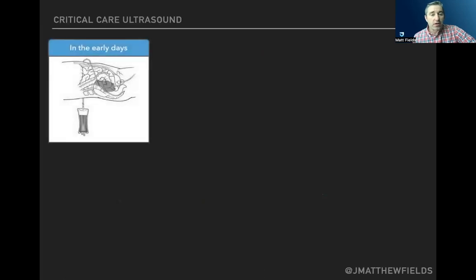The history of the EFAST exam starts going back to the early days when we did this procedure known as the diagnostic peritoneal lavage, or DPL. And this procedure had a lot of issues with it, a lot of limitations. For those of you who have done one of these or seen one of these, I think I saw a couple in my residency, but since then fortunately haven't seen too many of them. But it's invasive and it can even introduce bleeding, can cause other injuries.